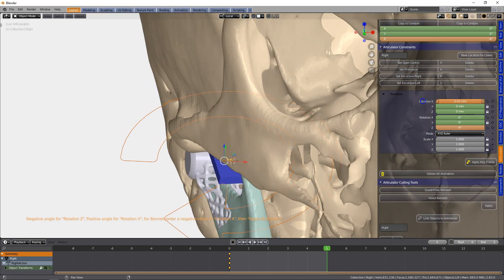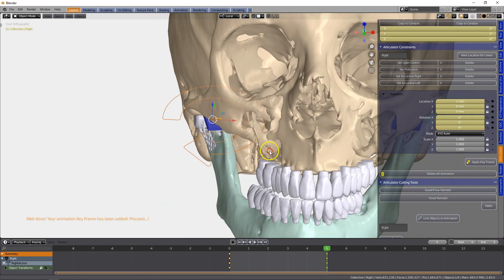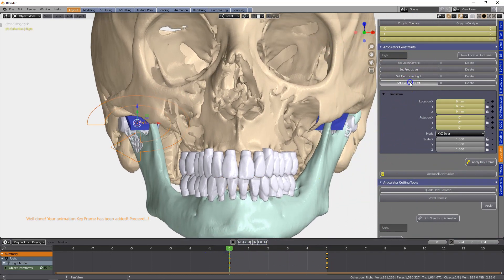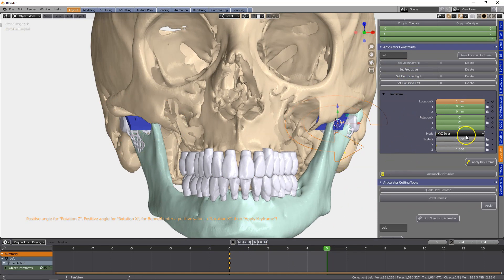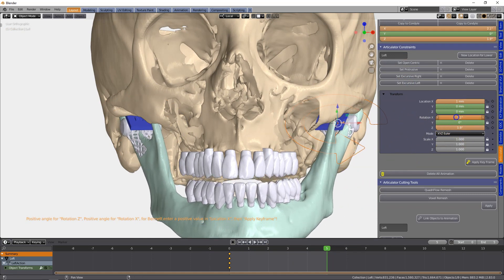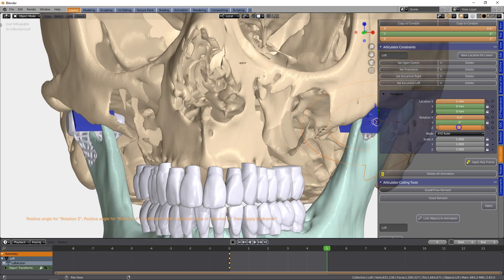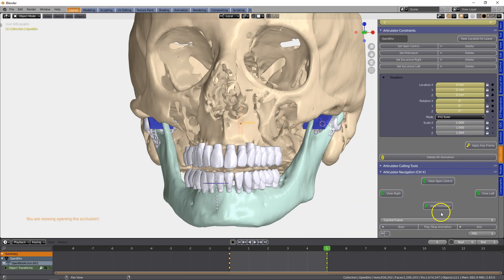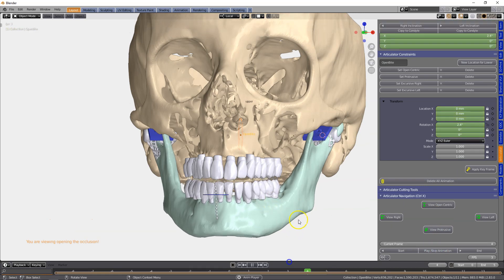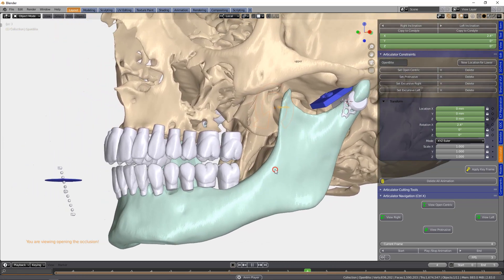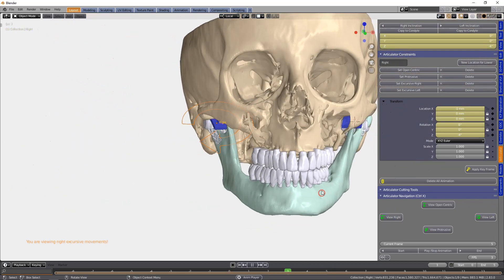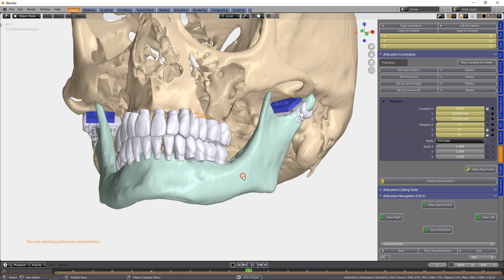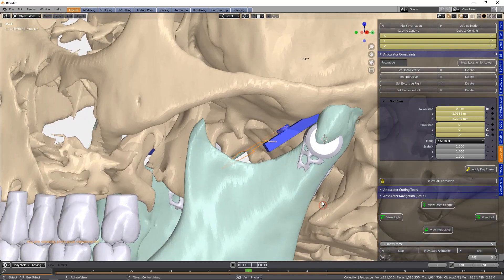Here the Bennett side shift — I'm going to put in minus one millimeter, so when the jaw moves it also moves across with the Bennett side shift as well. We're going to do the same to the other side and position the jaw accordingly. Here we can view all of the animations. The articulator has a shortcut key which is Ctrl+X, where we can call up the articulator at any time we like.